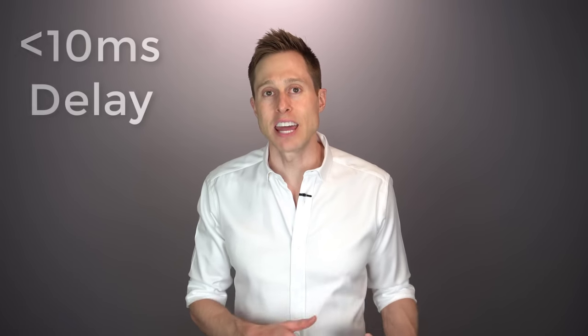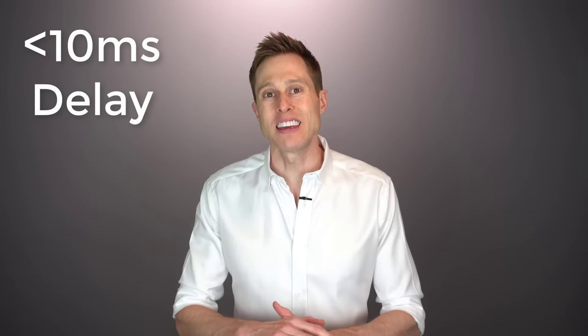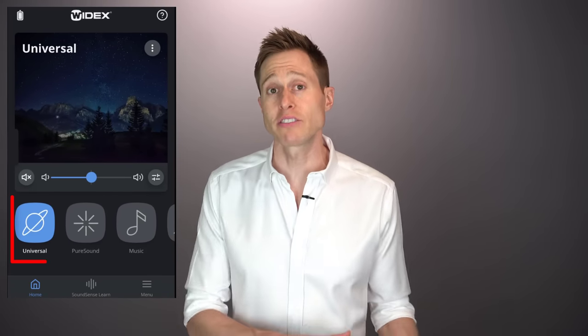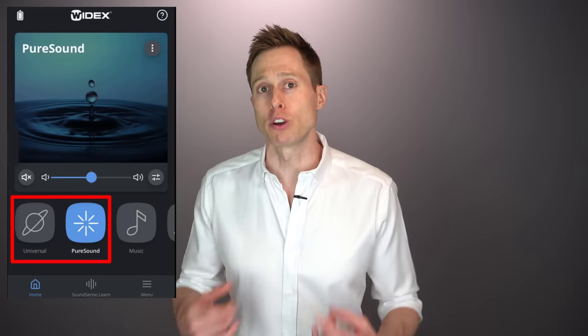Now, there is general consensus that anything less than a 10 millisecond delay is something that is imperceptible to a human being. That being said, it can't hurt to go lower in terms of a millisecond delay. In fact, you might even notice it as better sound quality. When I did a blind A-B comparison between the classic universal program and the new Pure Sound program, I actually preferred the Pure Sound program.